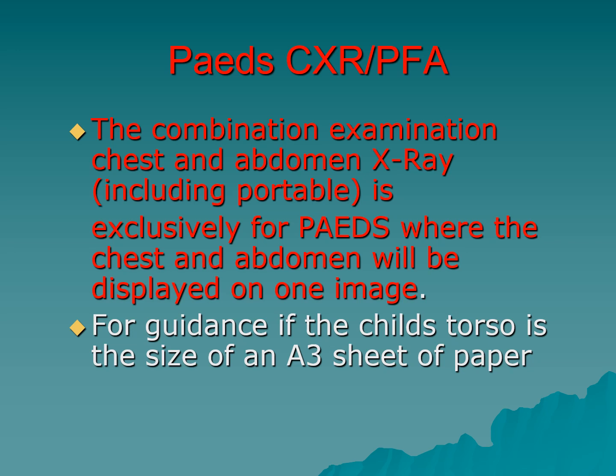The combination exam chest and abdomen X-ray, including chest and abdomen portable, is exclusively for pediatrics, where the chest and abdomen will be displayed in one image. For guidance, if the child's torso is the size of an A3 sheet of paper, then this is an acceptable exam.